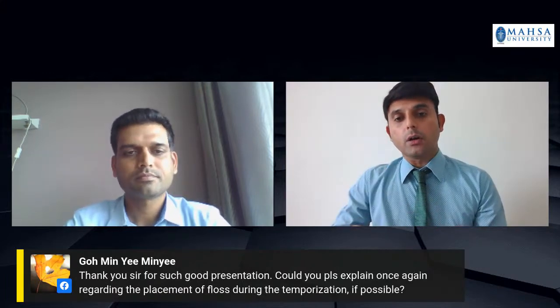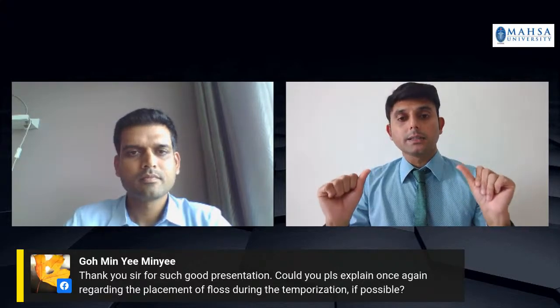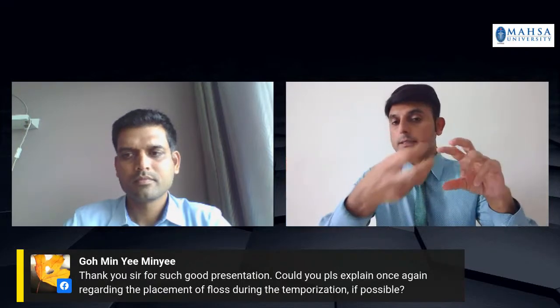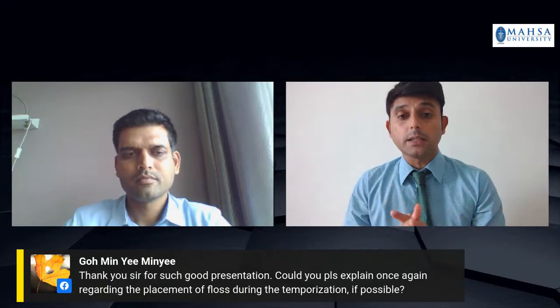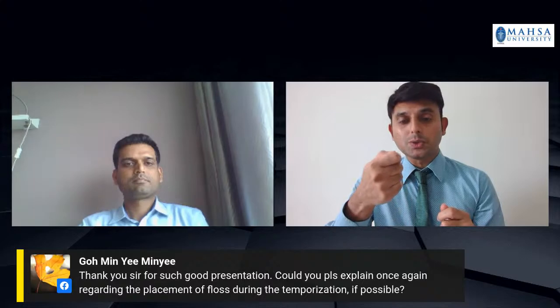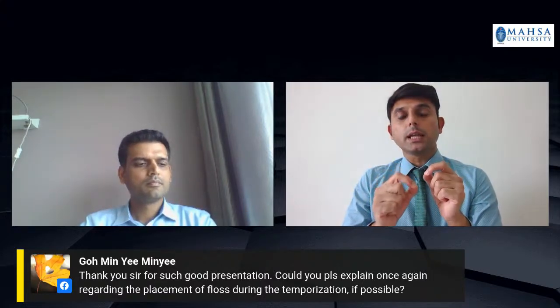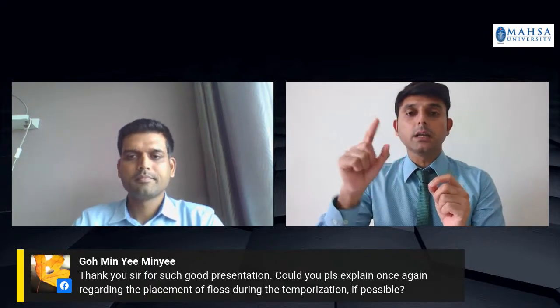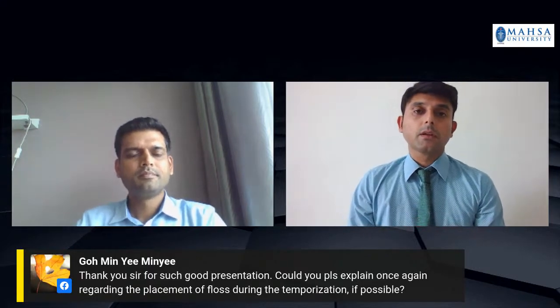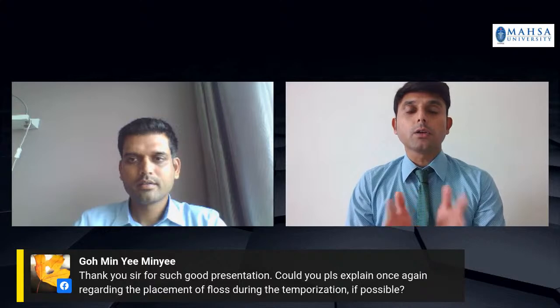So when you take out your putty index, normally you see that the temporary bridge is still sticking onto the teeth, right? Sometimes it doesn't come out with the putty index. If it comes out nice, but sometimes it doesn't come out. So in this situation, you can use the floss to pull out the bridge without breaking it. Plus, the floss will make sure that it will give you a nice gingival embrasure. I hope I've answered your question. If you're not sure, then you can contact me on WhatsApp.